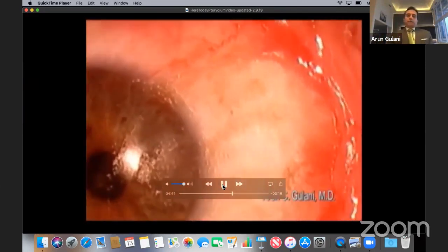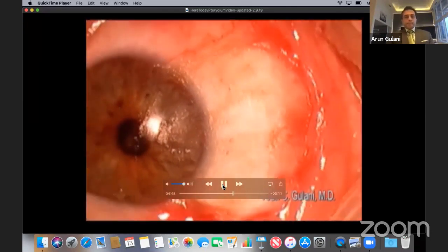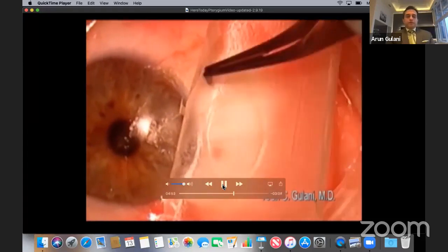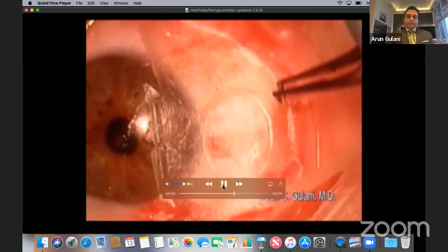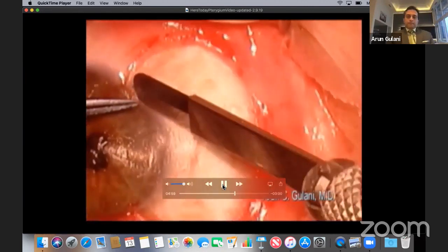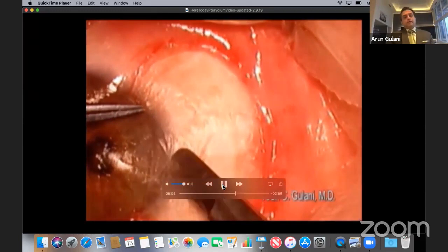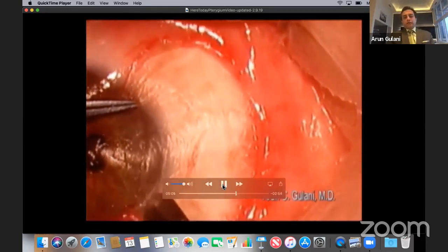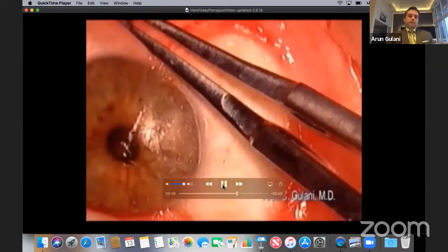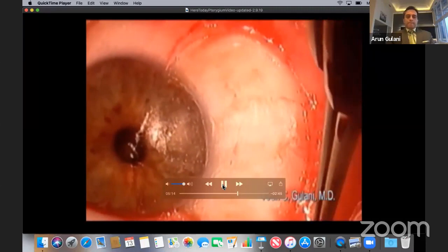Ready for receiving here. High mag picture. Accept the amniotic graft. Place it onto the area. You can use different ones. Glued into position, once again using the 2 Wexel technique to squeegee the graft. Very minimal glue needed. Now using a blade to trim the excessive amniotic graft at the limbus. Simple, smooth movement, peel off this excessive amniotic tissue. Sweep the fornices for any excessive glue that may prevent keratitis next day.